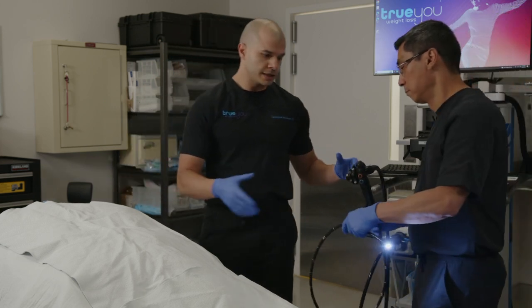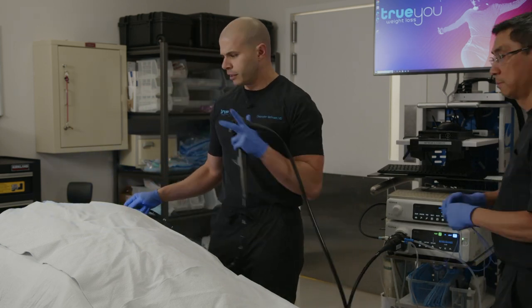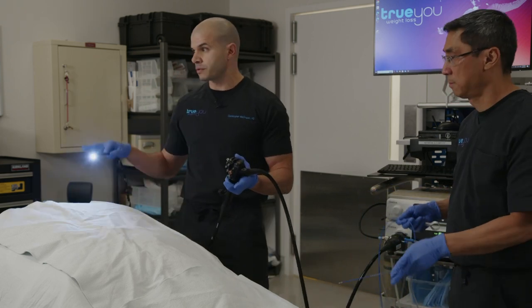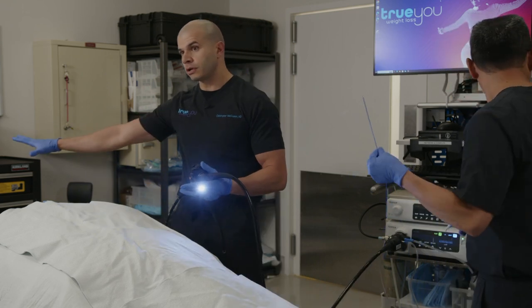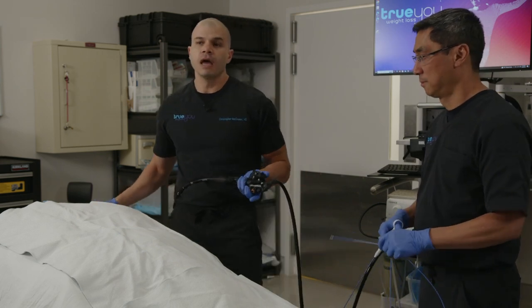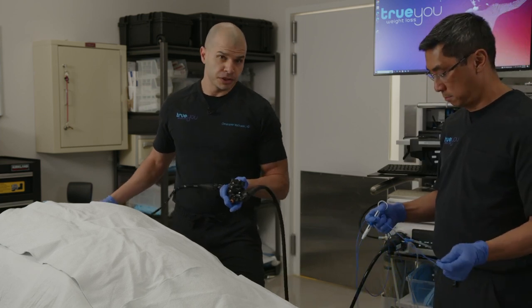So this is a fully endoscopic procedure. We are using Fuji endoscopes for this case today. And our patient is under anesthesia currently. She's sleeping. She does have a breathing tube in to protect her airway, and she's receiving propofol as her anesthesia. Jason here in the corner, we keep him off camera, but he is providing the anesthesia and keeping her comfortable and safe. So our patient today had a gastric bypass about 7 years ago and has experienced some weight recurrence.